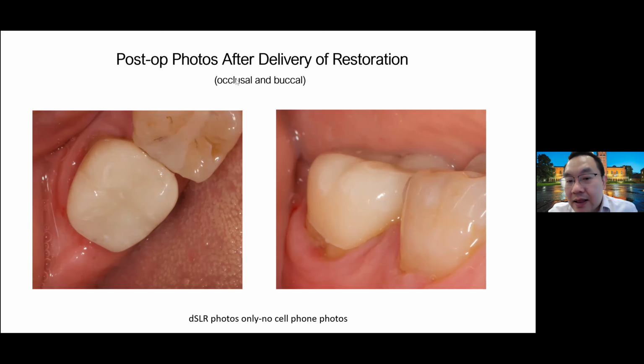That makes a difference. But the hardware is usually good, just like a car. Five years or so is no problem. And at some point, you might have heard of a lot of people downgrading the old scanners from the treatment planning room to a hygiene room, and then buying a new scanner that way.